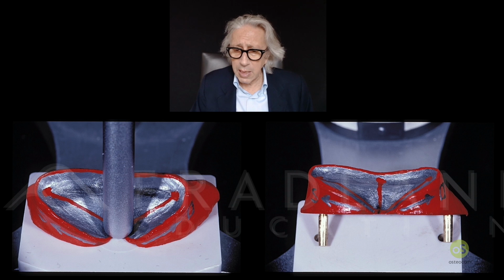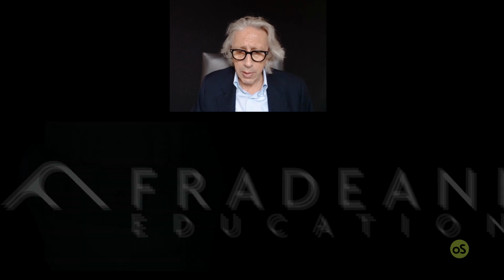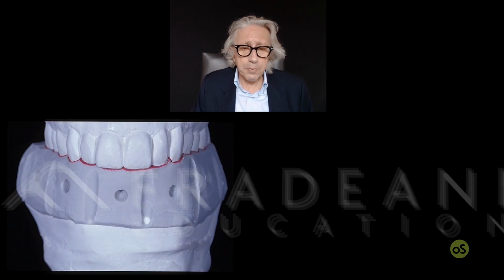forever. So this kind of anterior guidance is what the patient had already optimized, tested, proved, and adapted 100%. And once you do that, you need to copy it to have the replica in your box, in order to be able, when you build up the final restorations, to repeat it and to copy 100%.